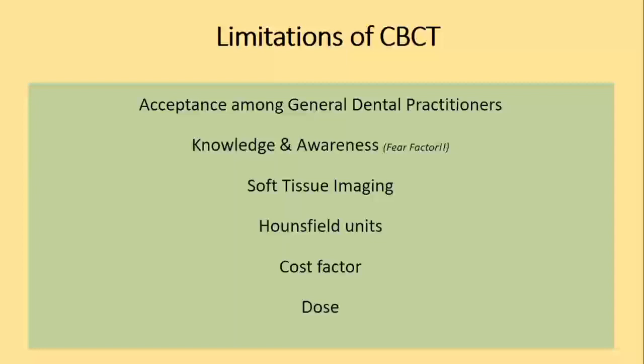A point to add, when I was talking about trauma, CBCT is good for trauma, but when it gets to the midfacial region, even a lot of patients who come for midfacial, I generally refer them out to a higher center with MRI, to the KMC hospital that we have, the Manipal hospital. We send them out for an MRI because when it gets to midfacial, it's no more hard tissue. You're actually thinking of brain. So you want to image the brain with MRI. So I wouldn't say there are a lot of roles on midfacial really for CBCT. Hounsfield units are not very accurate. Dose, of course, we just discussed, it's not really bad when compared to CT.